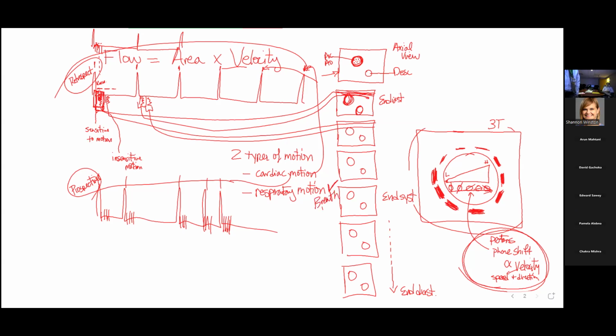But what you've got to be careful of if you're measuring blood flow is that someone doesn't take a big breath in and then hold it and bear down and have a Valsalva maneuver, right? Because what's going to happen? Well, you're going to increase that thoracic pressure, you decrease venous return, and you can make the cardiac output, which is what we're trying to measure right here, go down if someone has a Valsalva maneuver.